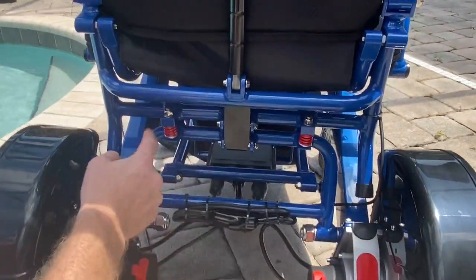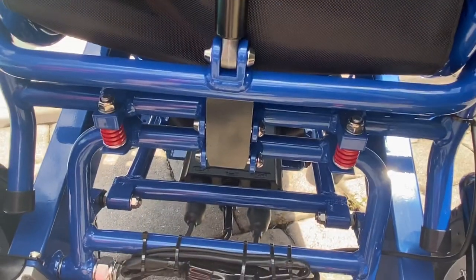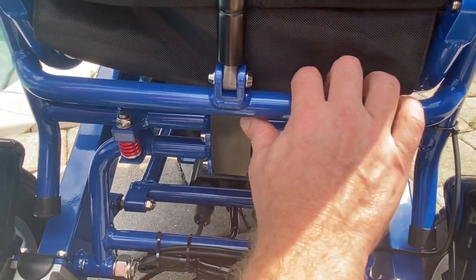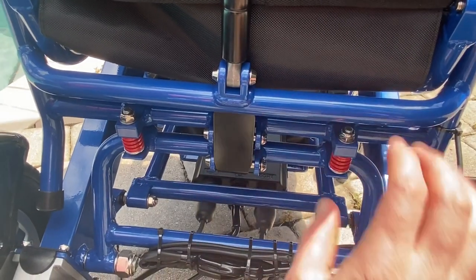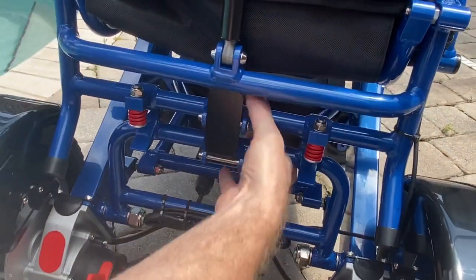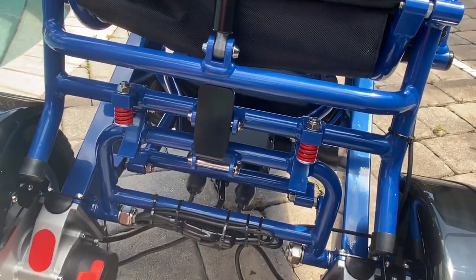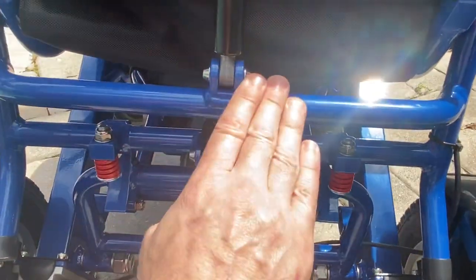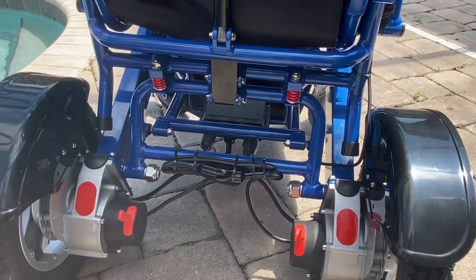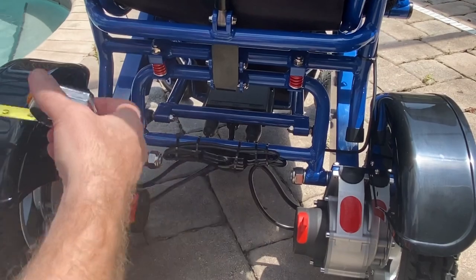We have two DuraShock shock absorbers on this chair that help absorb energy from the ground for a smoother ride. We also have a quick release latch that allows the chair to fold and unfold. We'll fold the chair up in just a moment. A few more things I want to point out before we get to folding — let's take a couple of measurements from the back of the chair.